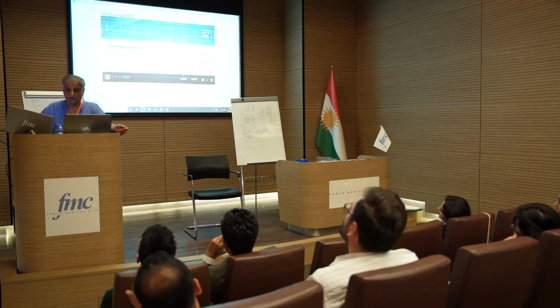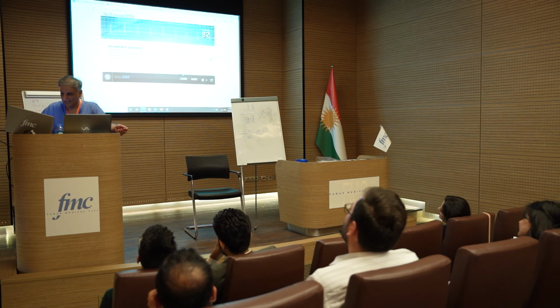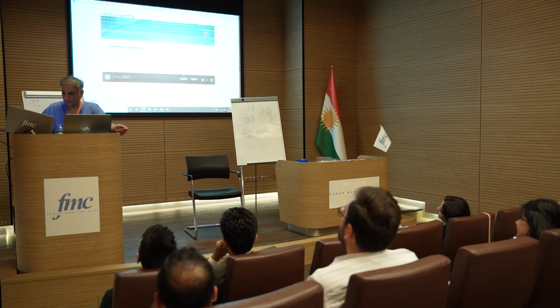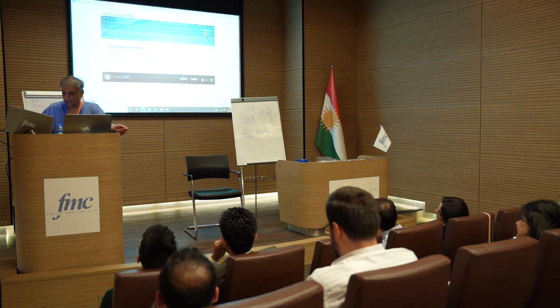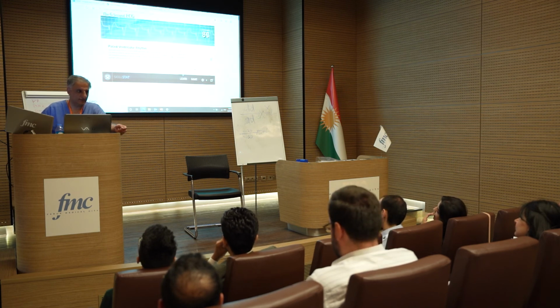Let's ask the surgeon. We can't help. Okay. What is this? This is a ventricular paced rhythm. Pacemaker. Well done.